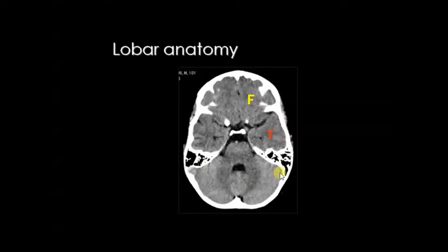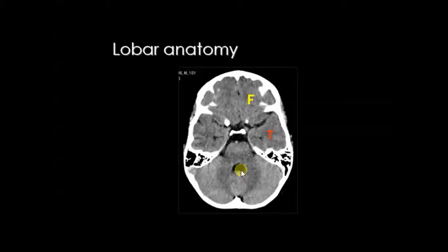If you get any pathology in the cerebellar structure, this is cerebellar dysfunction — so coordination, balance, and tone may be hampered. Another important thing: in front of the pons you can see a tiny hypodense area — this is the basilar artery. If you go in front, this is the frontal lobe, and on both sides is the temporal lobe. So at the level of the fourth ventricle, you can find only the frontal lobe and the temporal lobe.